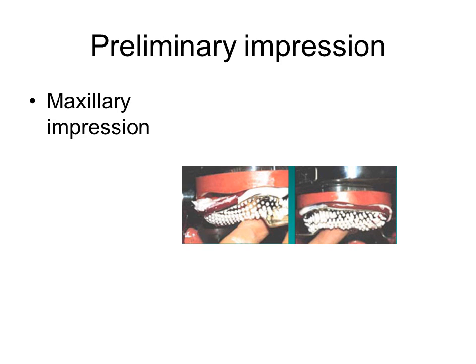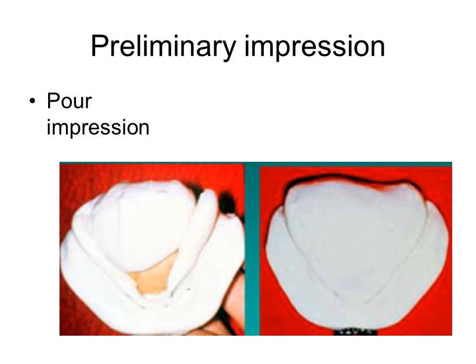Once set, lift the soft tissue to break the seal. Close slightly and remove the impression in one motion. Inspect for adequacy of the impression. All pertinent anatomical structures should be noticed with no gross voids in the impression. For neatness, the tongue space is filled using a wet paper towel and alginate, using care not to obliterate the lingual border.